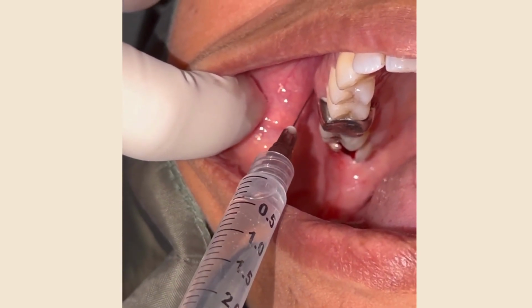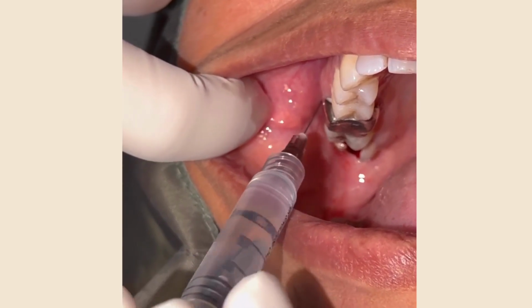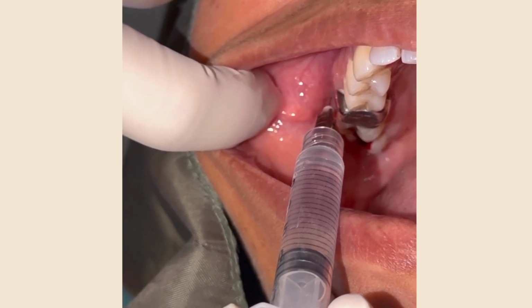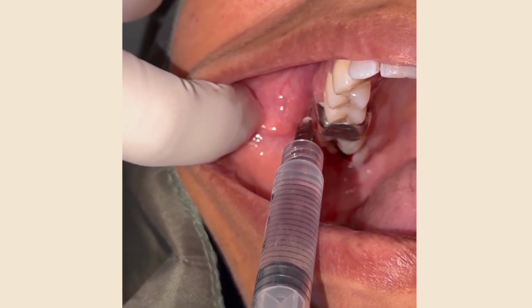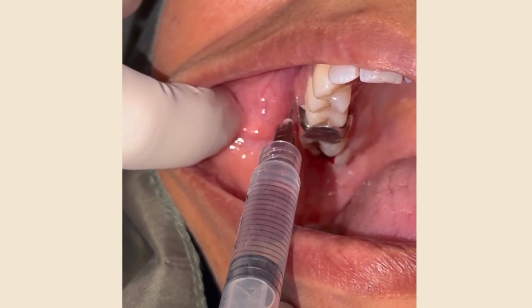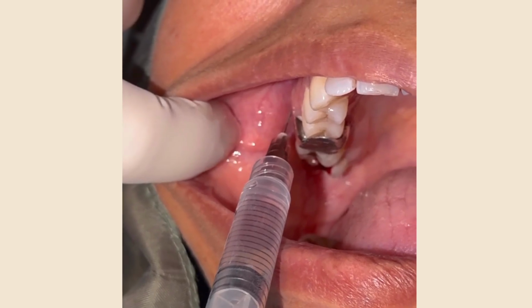The live demonstration of posterior superior alveolar nerve block. Here the operator goes upward, backward and inward above the height of the mucobuccal fold above the maxillary second molar and injects the anesthesia to anesthetize the posterior superior alveolar nerve.